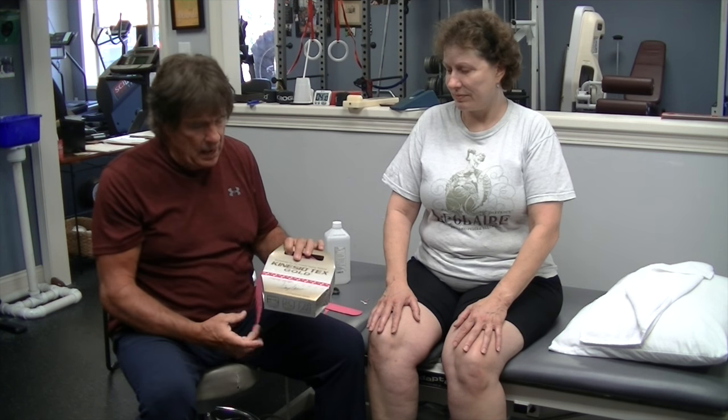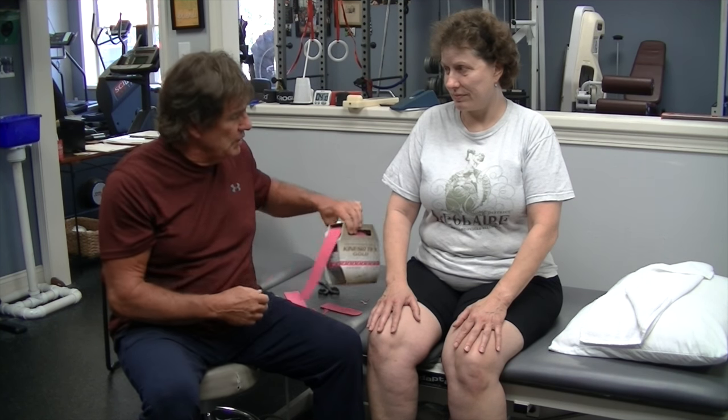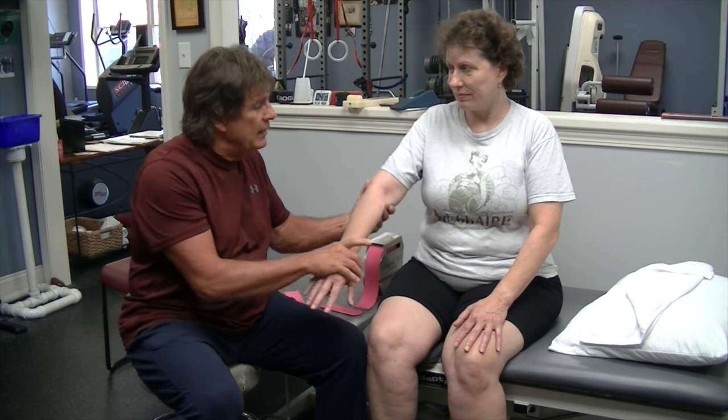Hi, this is Mark at Physical of Eversville. Got my good friend Katie here today, and now that this is an Olympic year — which I am totally hooked on ever since I won gold in 1952 — back then we didn't have kinesio tape so I had to just wing it. But now everybody wants to know about kinesio tape because all the athletes are coming out. So I'm going to show you one method of using it, which is for elbow pain or tennis elbow.